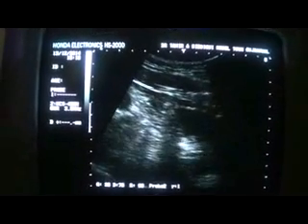As I move the probe transversely, this is the urinary bladder.